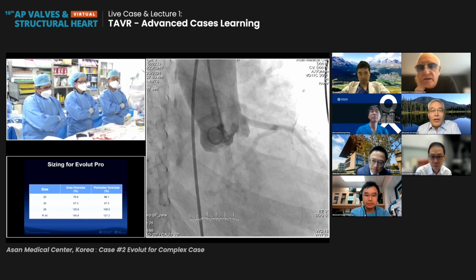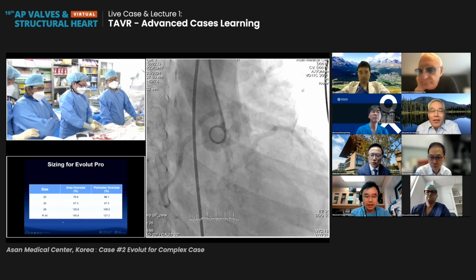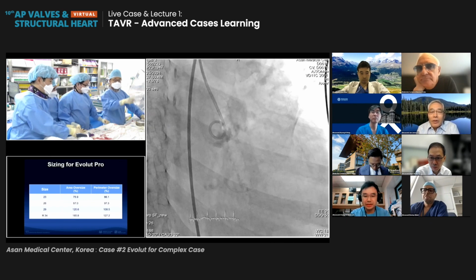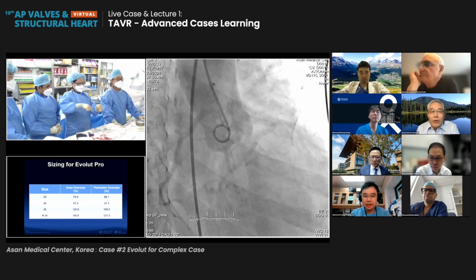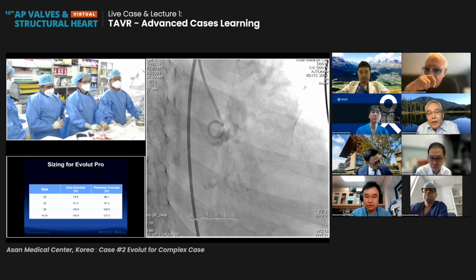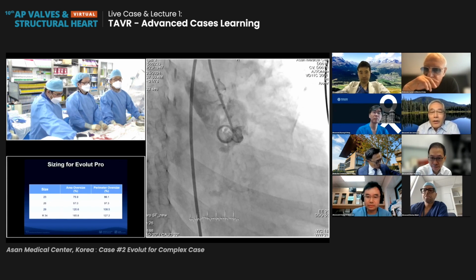Yeah. Can I comment? Yes, please. Okay, great. Hi. I know you don't have that valve, but at our center, I would use the J-Valve. This is definitely a moderate risk for coronary obstruction, and the J-Valve would be perfect for this situation. But I agree, if you choose Evolut Pro, I would prefer to choose a smaller one after ballooning rather than an oversized, too-big one.